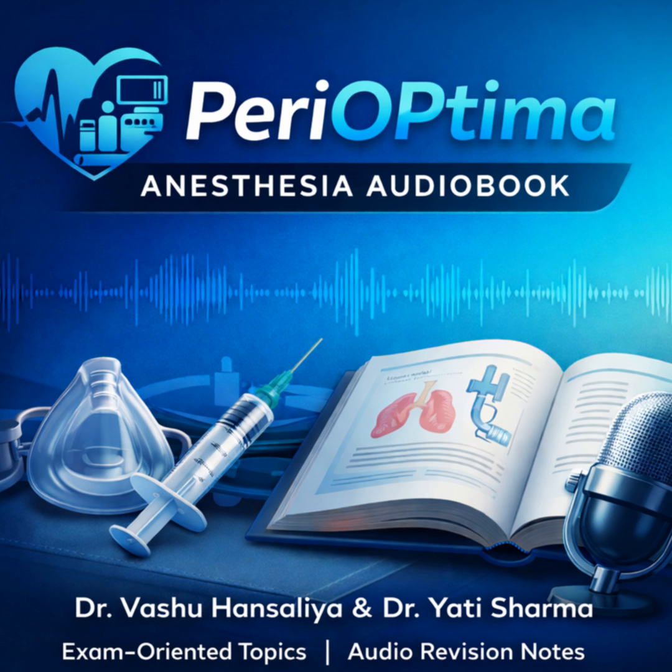Section 7. Intraoperative anesthetic considerations. We're in the theater. What changes in my day-to-day management? The monitor is now your dashboard, and the ECG needs to be clean. The IABP console usually uses the R wave to trigger its cycle. What about diathermy? The surgeons love their bovie.